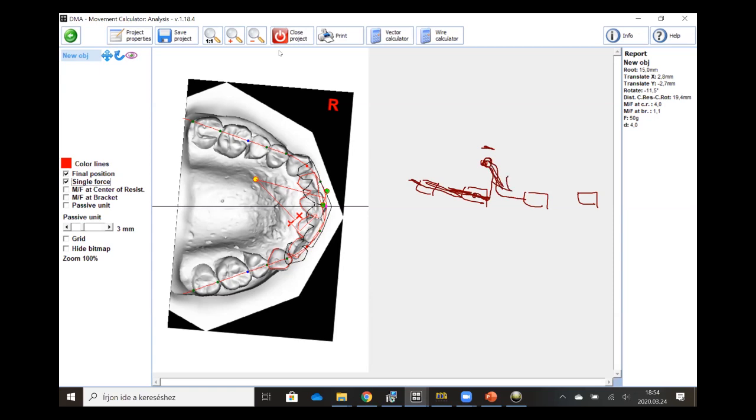So, for example, we can bond an extension on the central incisor, and reach that. There are other options, of course. Another thing you can do, not even bonding: if you have a very wide crown that allows you to place another bracket here, this could be easier, but this is not very common.